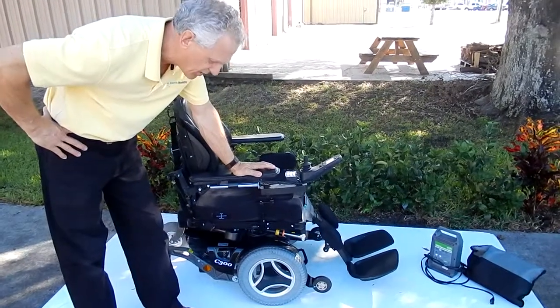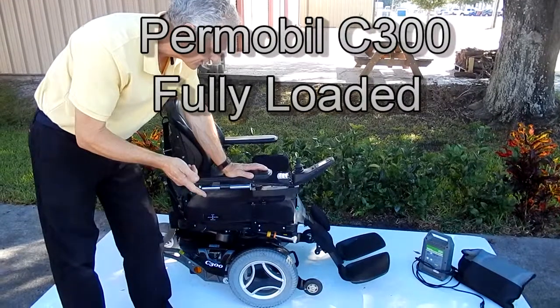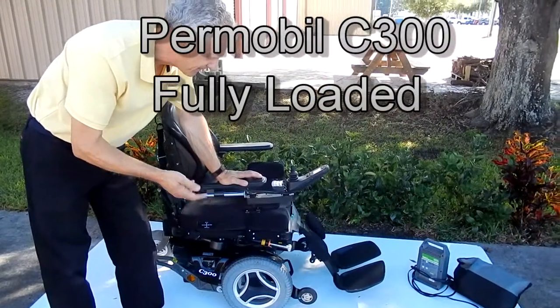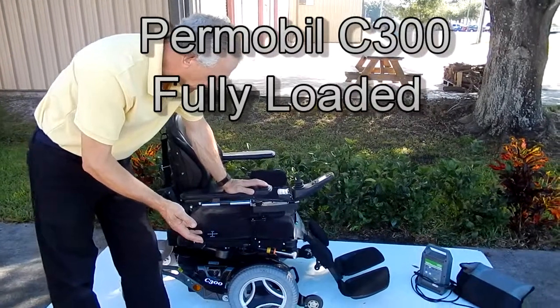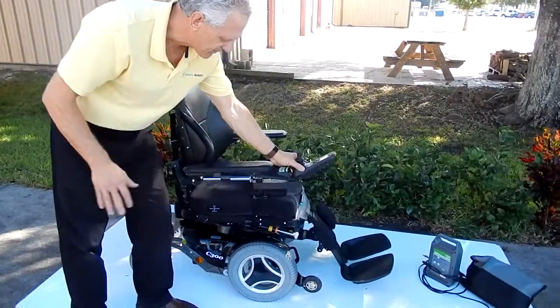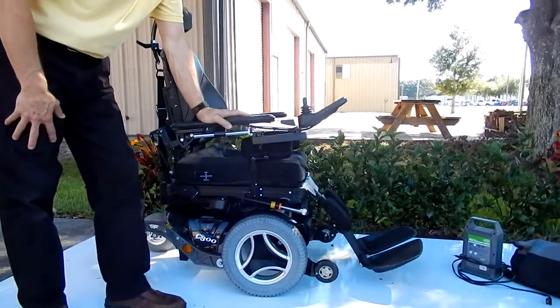This is a Permobil C300, fully loaded. It has electric seat lift, electric tilt, partial recline, and electric legs. This chair is fully loaded — it has everything with it. It even has a swing-away joystick. Permobil makes one of the best chairs in the world.